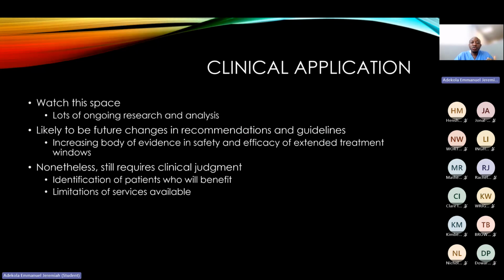I think for the other application of this CT perfusion, we can use CT perfusion also in areas of stroke mimics, especially patients with seizures. They could either have hypoperfusion or hyperperfusion, depending on the phase of the seizure, like if they were in their ictal phase or post-ictal, and it's often on both sides of the hemisphere, unlike if it were to be due to stroke. And there is ongoing research about further application of CT perfusion.